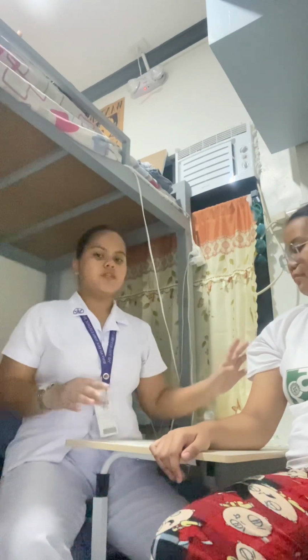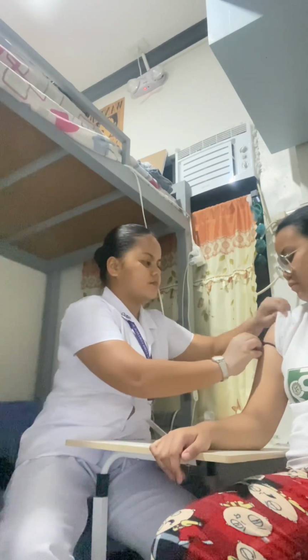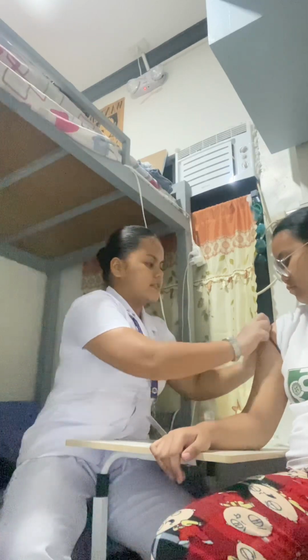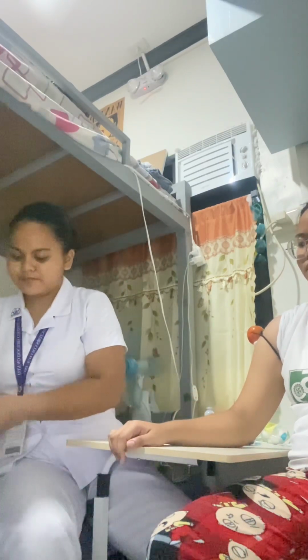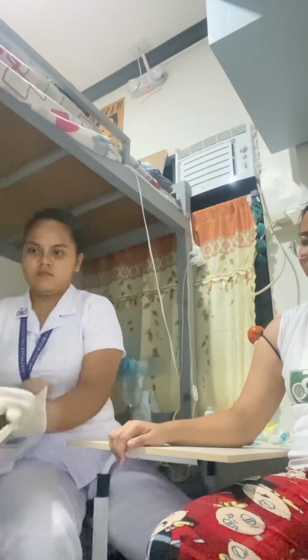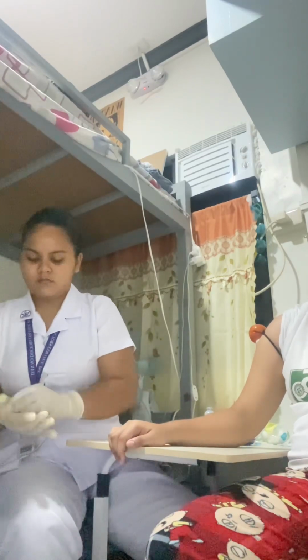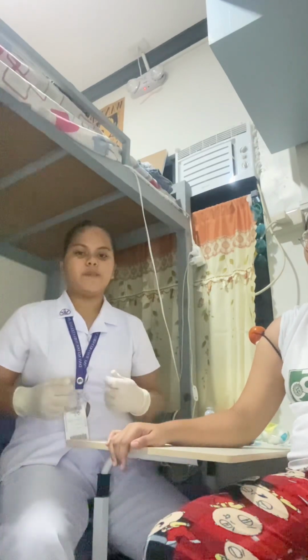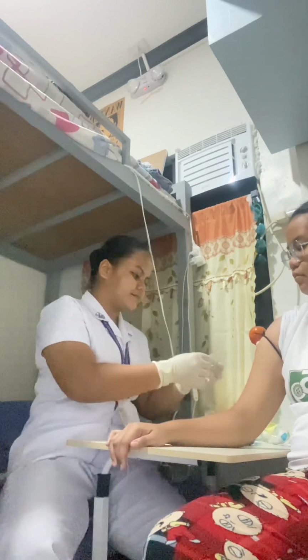Today I'll be using the deltoid site for the intramuscular injection. So I'll be exposing this site now. Now I have here the deltoid site to administer the intramuscular injection. After that, I'll apply gloves. Now that I've already applied gloves, I am going to clean the site using an alcohol swab.